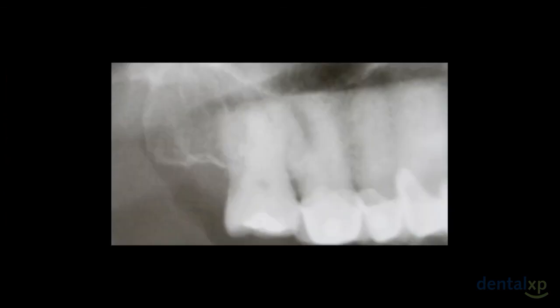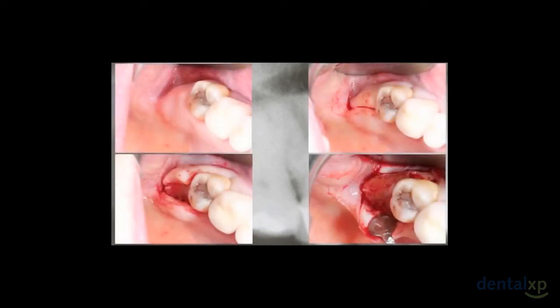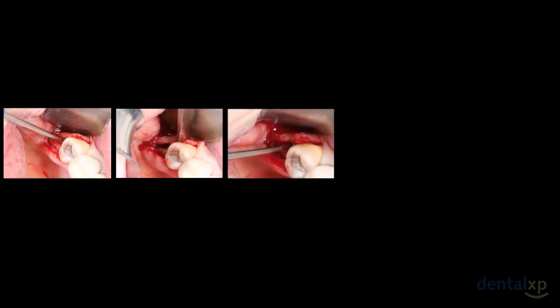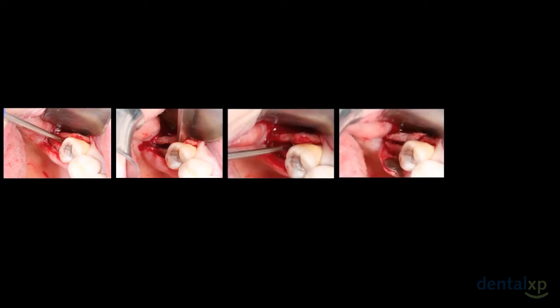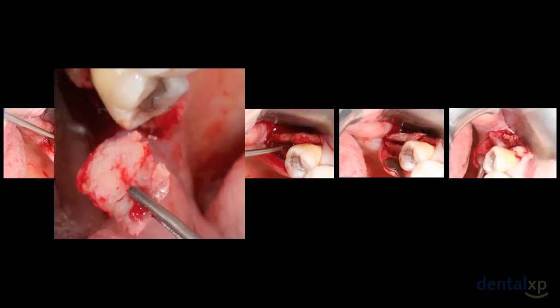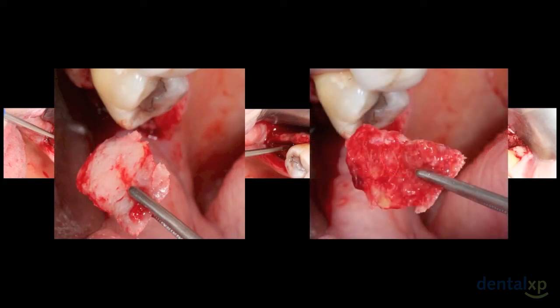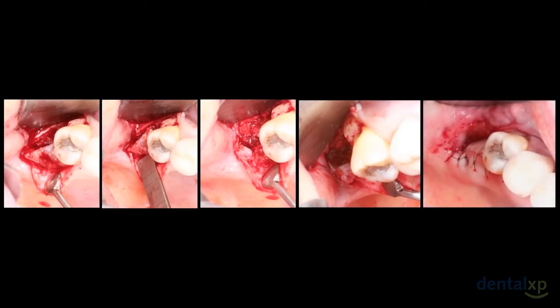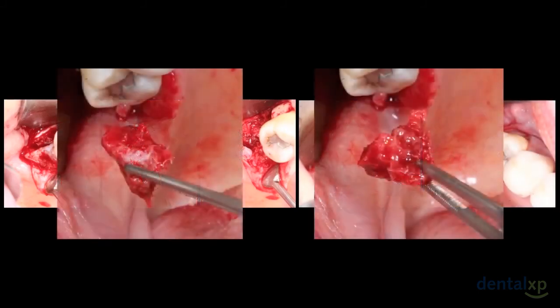We selected the right tuberosity due to the good amount of available bone. Firstly, we split the tuberosity in two halves. We harvested the outer half using a straight chisel, and here we can see the cortical and medullary portions. After that, we harvested the inner half of the tuberosity. Note the excellent vascularization of this bone.